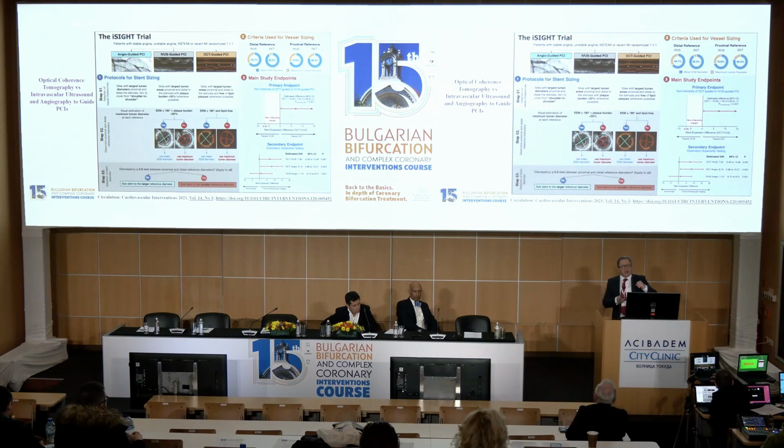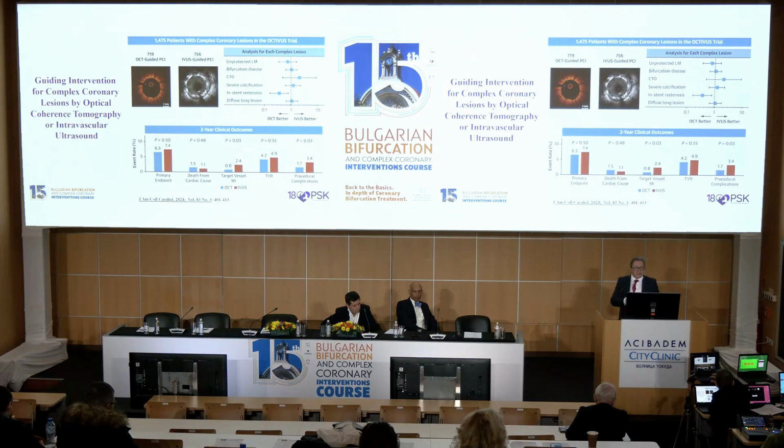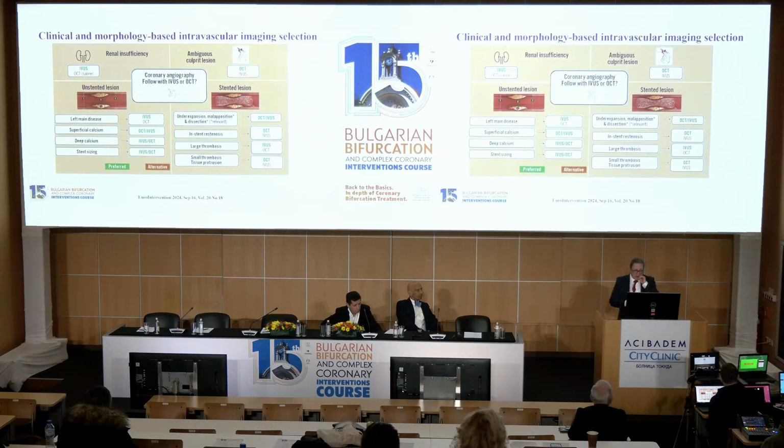There are some superiorities compared to IVUS that we have to keep in our mind. In terms of procedural complications, as you know, with IVUS catheters, we can make more harm, more problems and complications than with contrast or saline infusion.